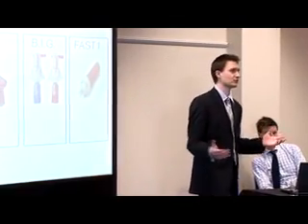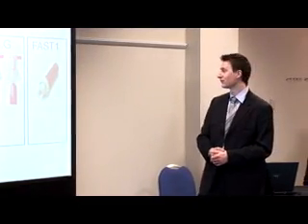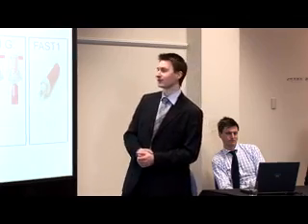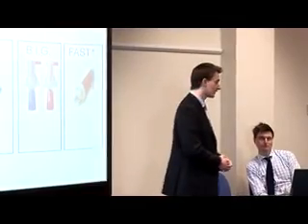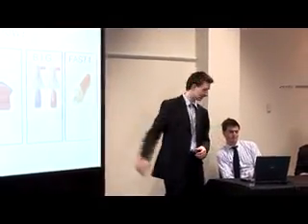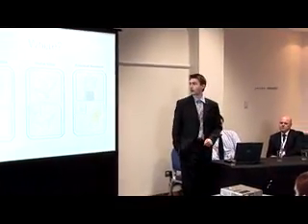There are lots of videos on YouTube, as there always are, of various people getting them put in, various awake people who don't actually need them, big buff army guys, perhaps not our standard population, who are getting sternal ones in, so feel free to look that up. But we're going to be talking mainly about the Cook and the Easy IO needles. So where do you do it?